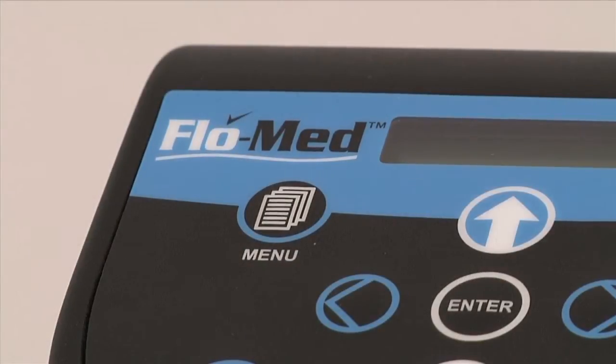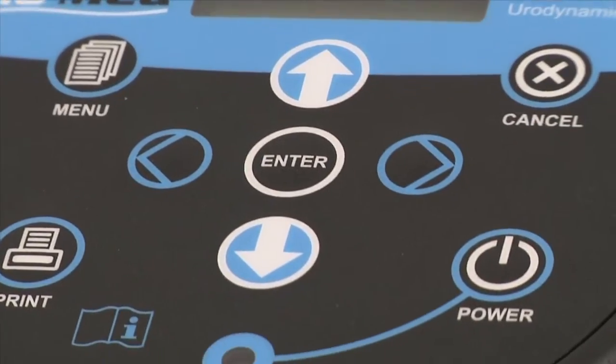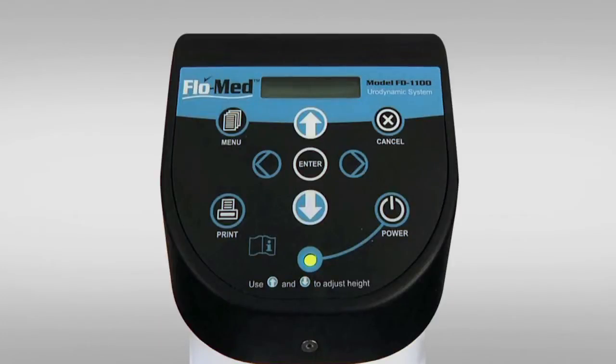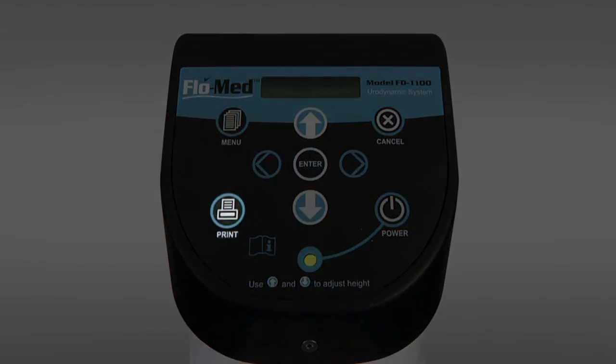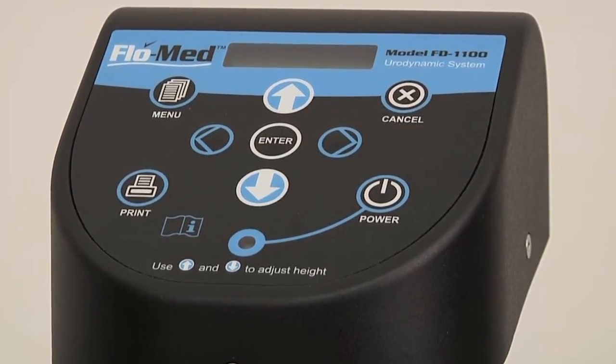The FlowMed 1100 is doctor-friendly. It has a built-in computer chip which determines when to start measuring as well as when to stop its measurement. As many printouts as needed may be generated by pressing a single button, and other functions are also easily accessible by means of a simple keypad.